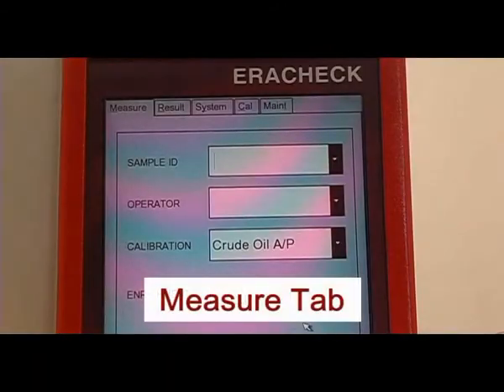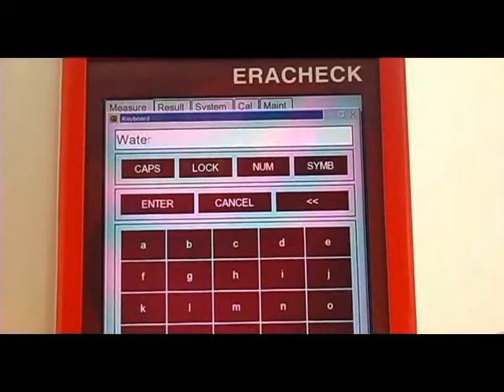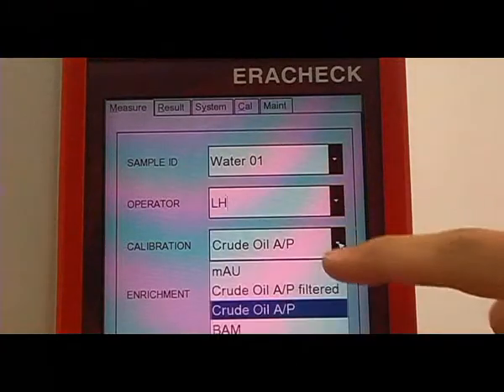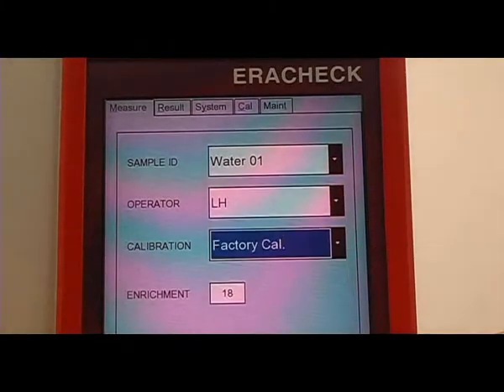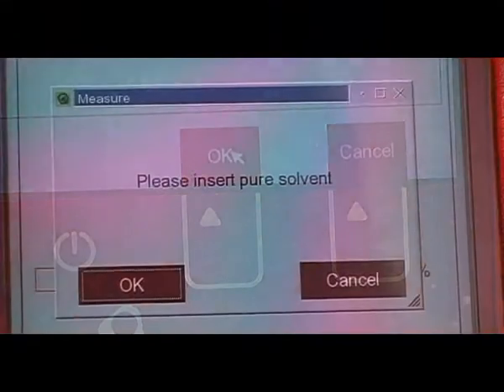After power on, the Eracheck shows the measure tab. Enter sample name and operator. Choose the preset factory calibration and set enrichment to 18. Press run and follow the instructions.